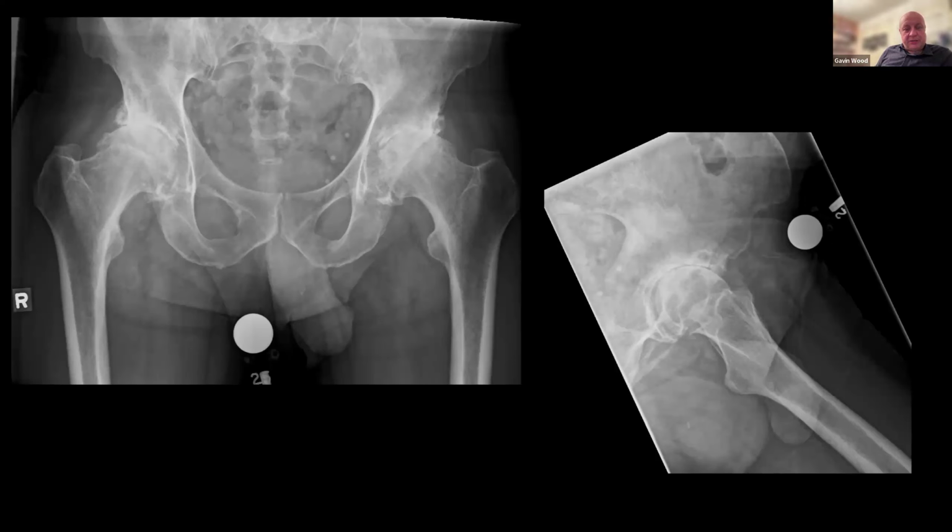When I do bilaterals, I always check with the anaesthetist once I've completed one side to see how the patient is, see what our blood loss has been, how stable the patient is, and if there's any concern with any of those, then I'll say, okay, that's fine. We'll just stop and we'll do one today and we'll bring them back.